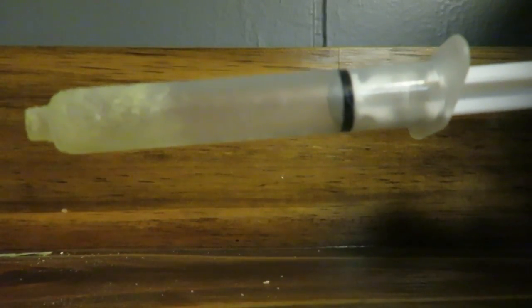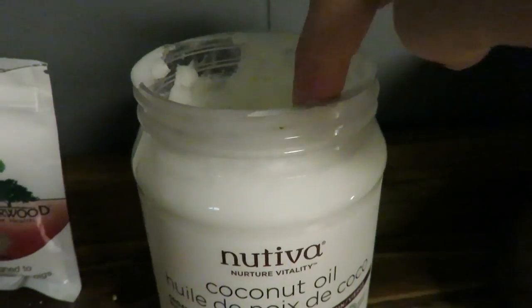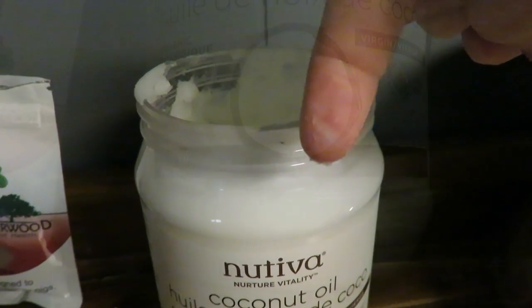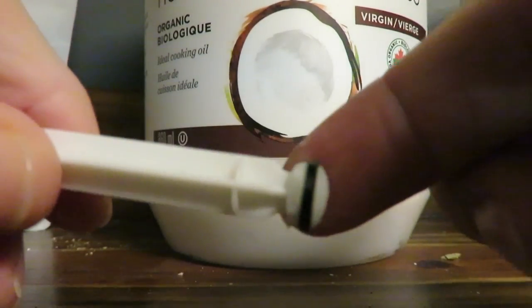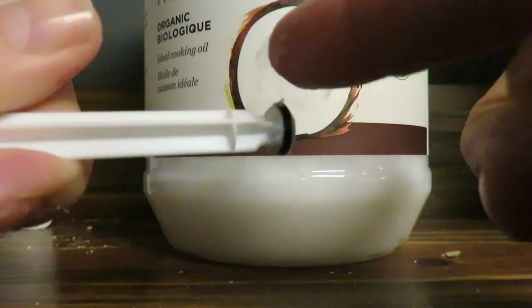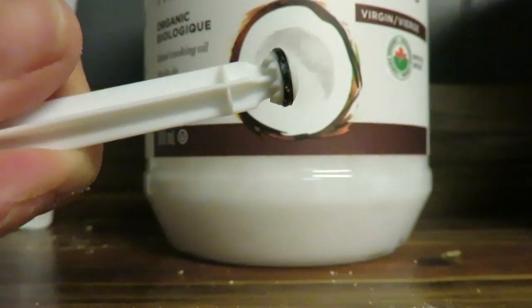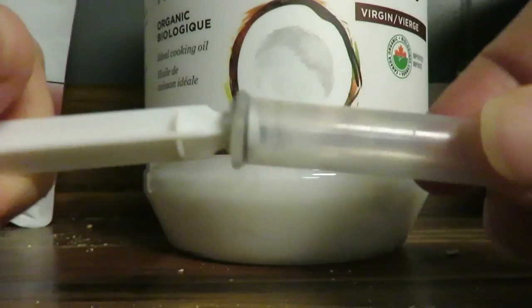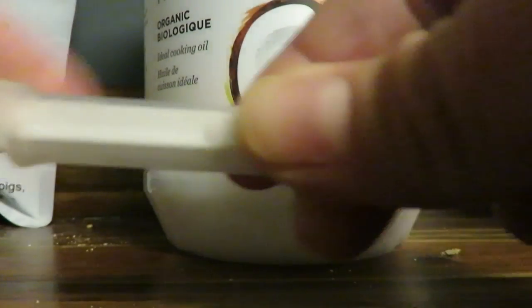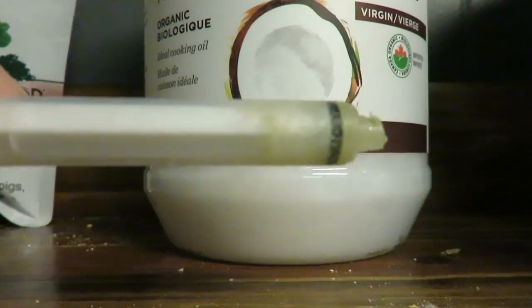Do you want to know how to fix that? Grab some cold-pressed coconut oil, just get the tiniest amount on your finger, put the syringe around, and get the black part — the little stopper — covered in the coconut oil. And now it works just as good as new.